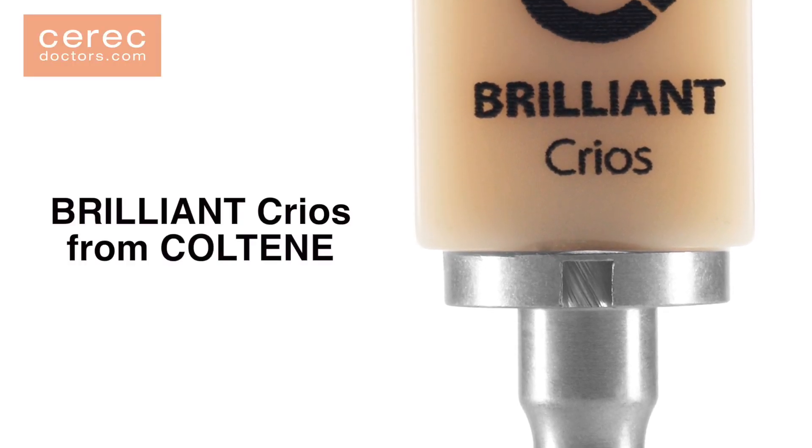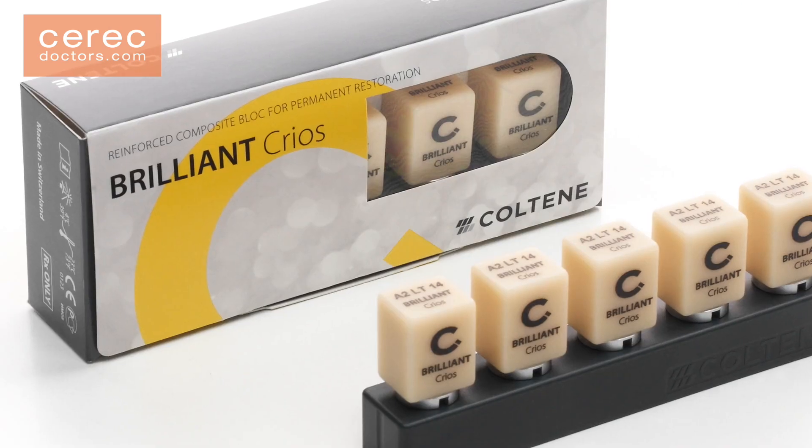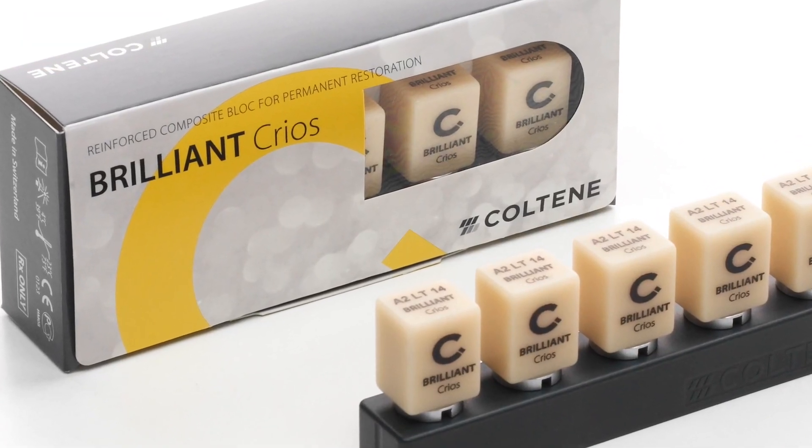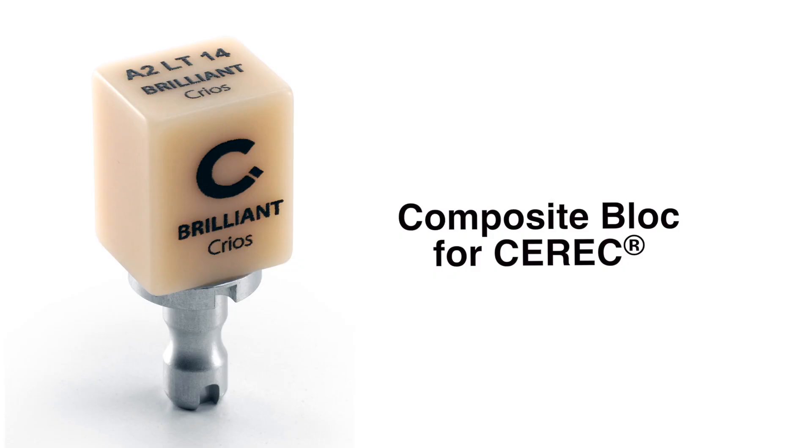Brilliant Krios is a new reinforced composite block from Coltene that features a rapid fabrication process with no firing required. Krios combines the advantage of a hybrid composite material that is fabricated with the CEREC CAD-CAM process.